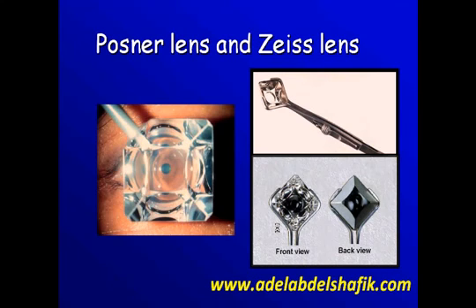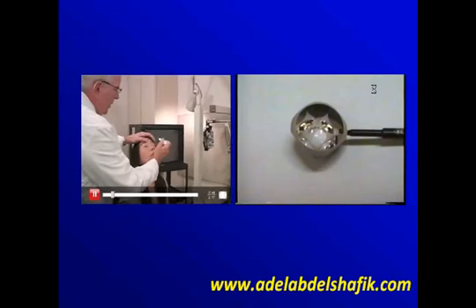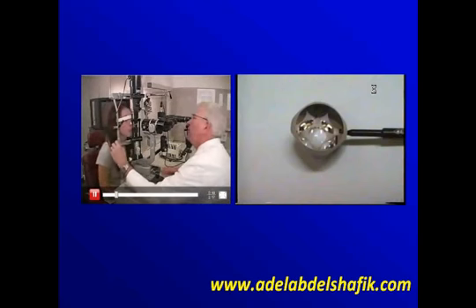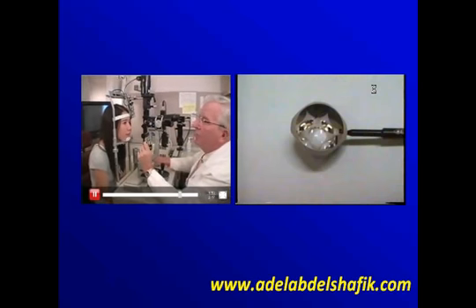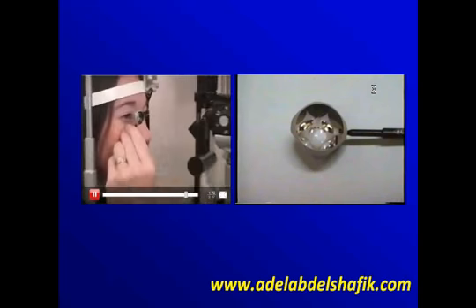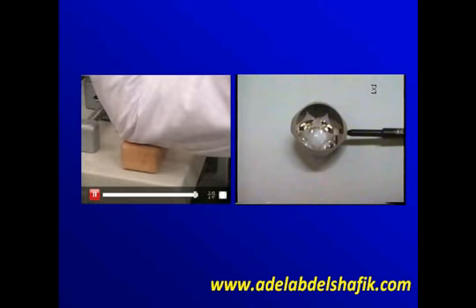Another lens which is quite important is the Posner lens or the Zeiss lens. This is the way to apply the lens. You just put local anesthesia, level the position of the eye, then this lens is applied directly. We don't need to apply any visco underneath this lens. It's better to have your elbow supported.